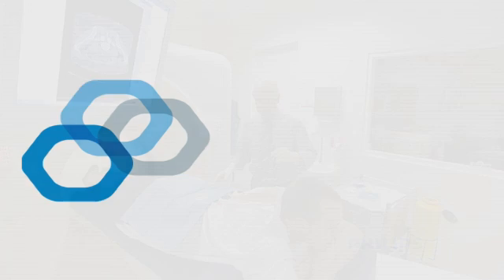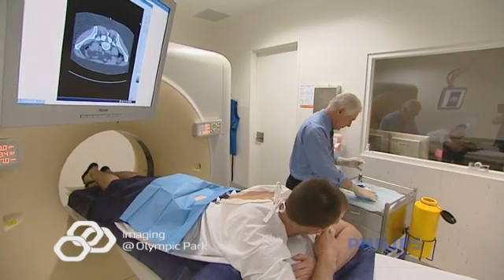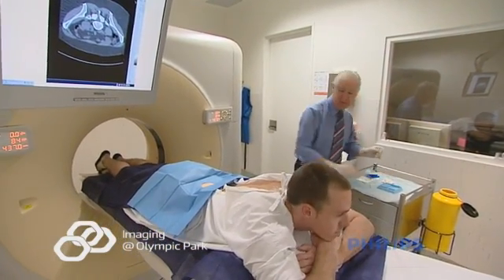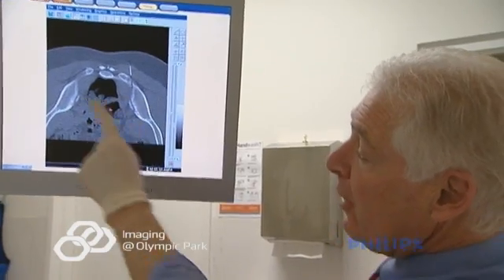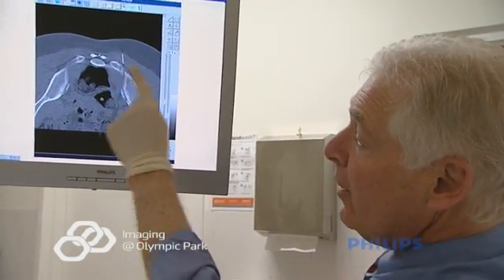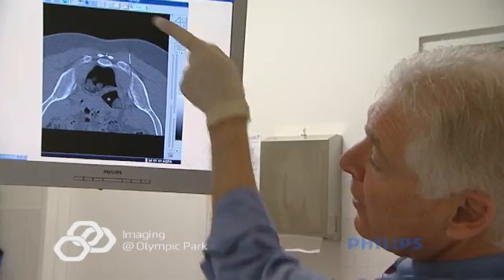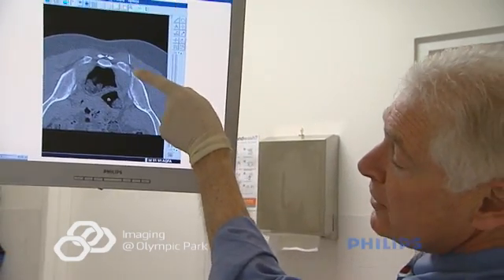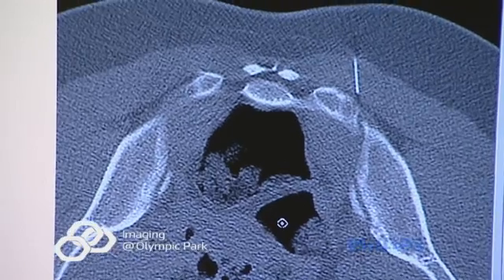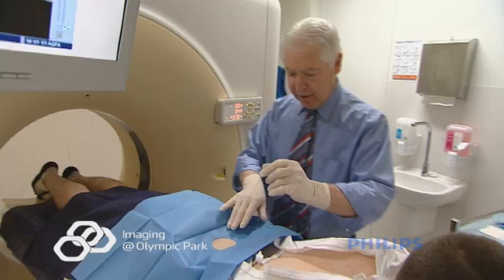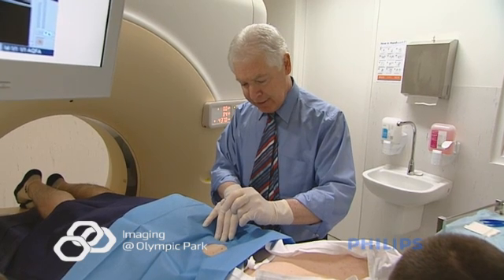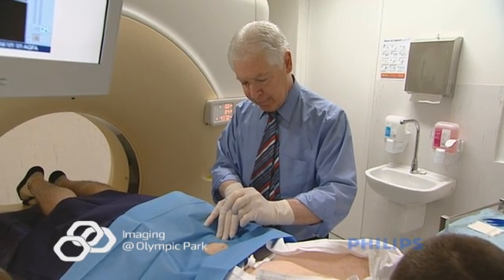Facet joint injections are performed to relieve back pain and muscle spasm. The procedure will take approximately 10 to 15 minutes. We use CT scanning to accurately assess the state of the facet joints and to accurately deliver the injection. Our CT scanner has 64 slices to optimize the anatomy. Precise delivery of cortisone will maximize its effect and avoid any potential complications.